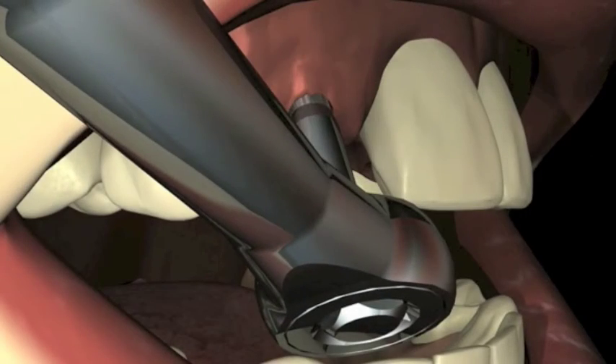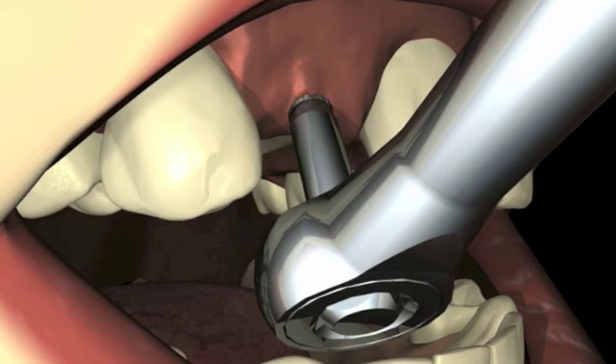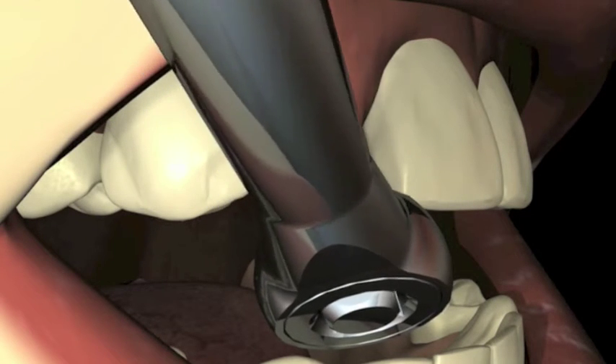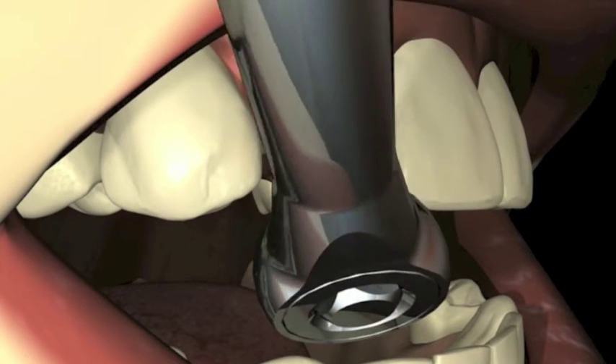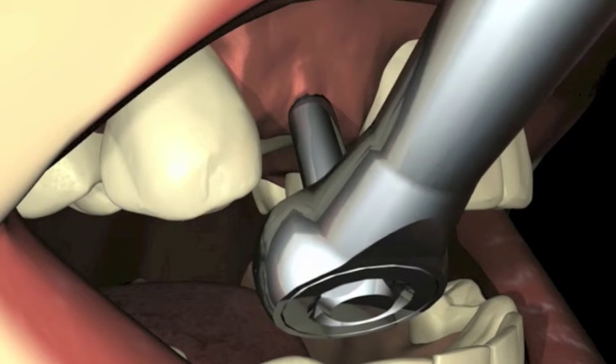Final implant seating is accomplished when the ratchet driver, or the contra-angle driver, is flush with the surrounding gingival tissue. At this point, the implant is securely in place. The gingival collar is in its proper relationship with the soft tissue, and the O-ball abutment is at its correct height.